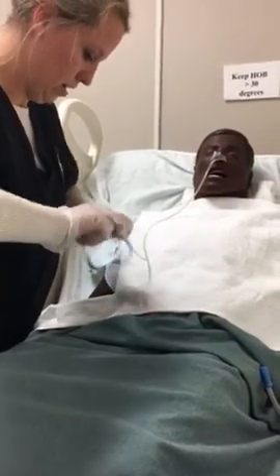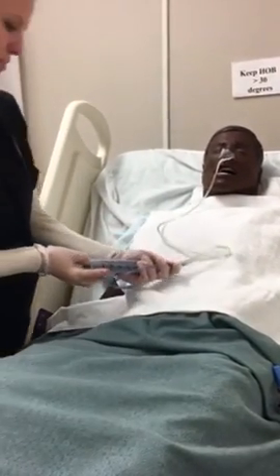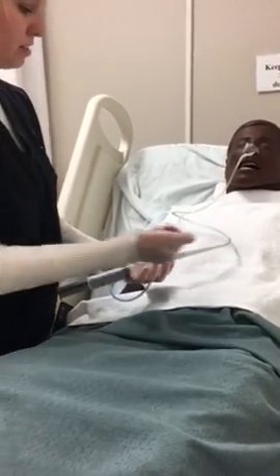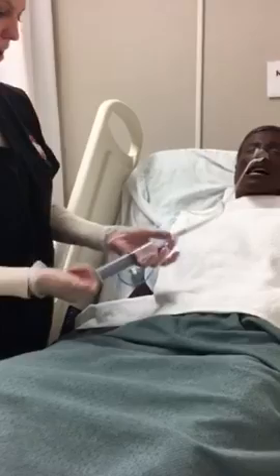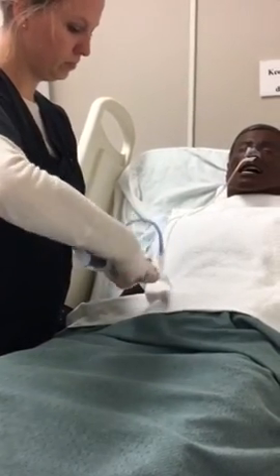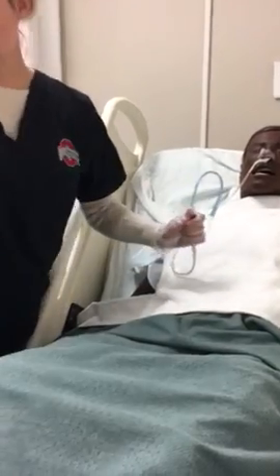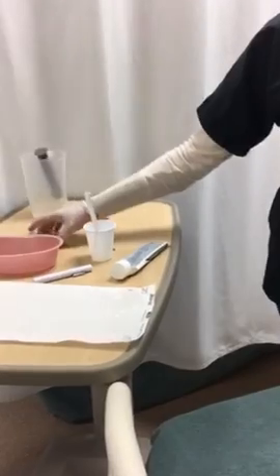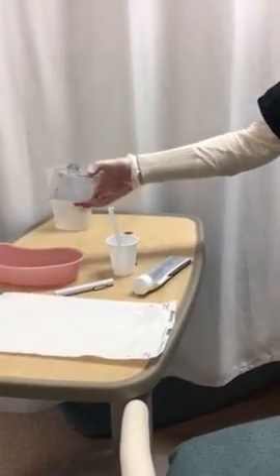So I'm going to touch the tubing, and then I'm going to aspirate to verify that it's placed in the stomach. Ideally, you're going to see some of the stomach contents come back into the syringe. And then I would put those into the emesis basin, and then I would test with my pH paper to make sure that we do have stomach contents. For the sake of time, I previously added all my equipment.